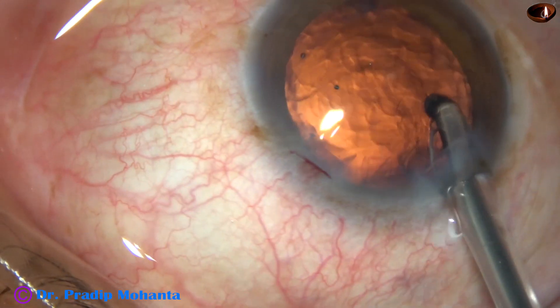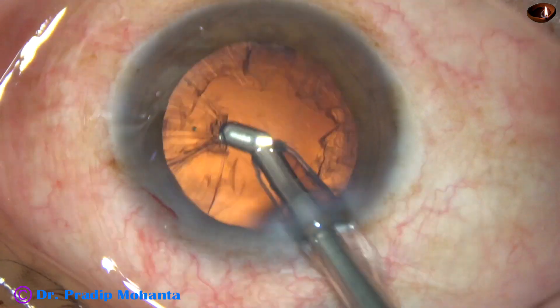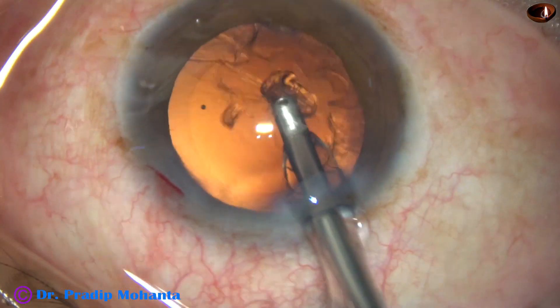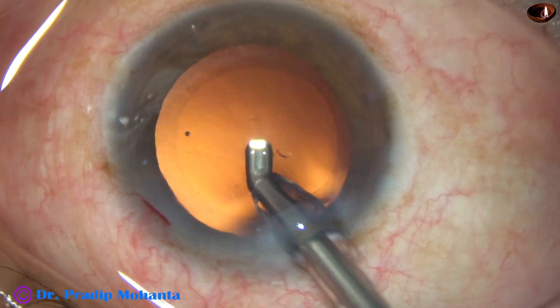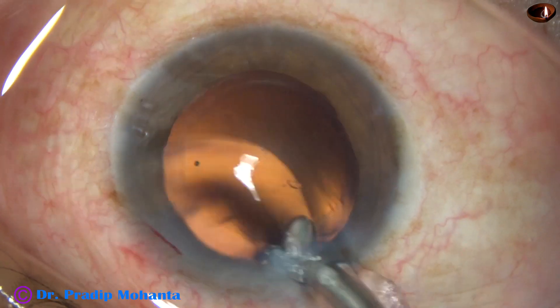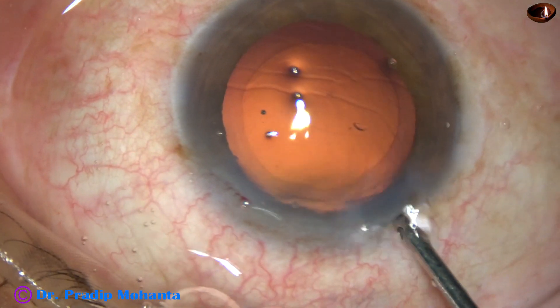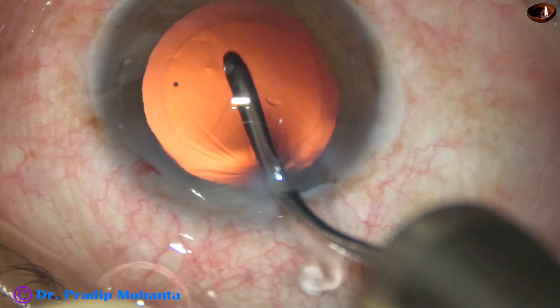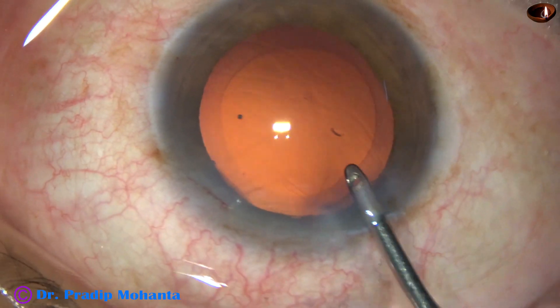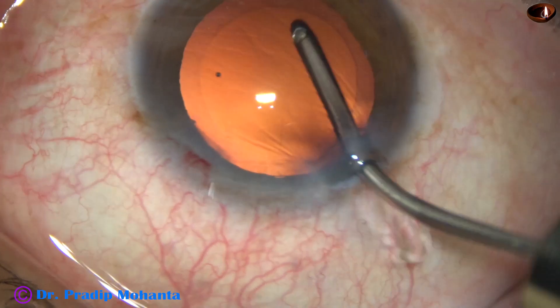Friends, if we can develop this skill of making a round rhexis, we can do without a femtolaser. If you can afford a femtolaser, it's fine, but many of our colleagues will not be able to afford it, and we will not regret it if we can develop this skill of doing a round rhexis. Then, hydrodissection is done.